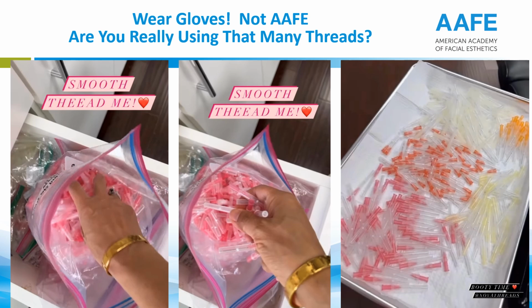But by the way, these are smooth PDO threads. I'm going to show you a crazy case later. If you're putting in this many smooth PDO threads on a patient, you are anesthetizing them. It's going to take an hour, hour and a half, 2 hours. What are you charging them? A lot of money for this.